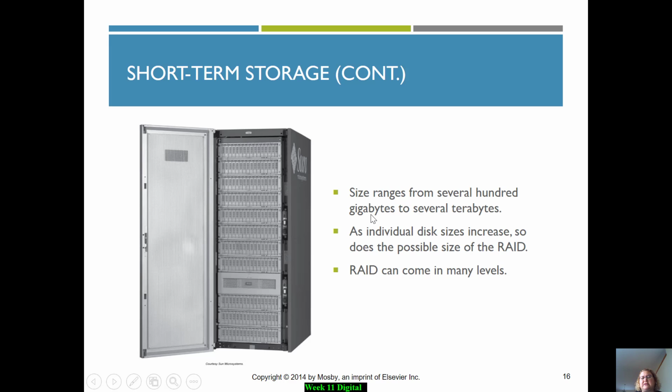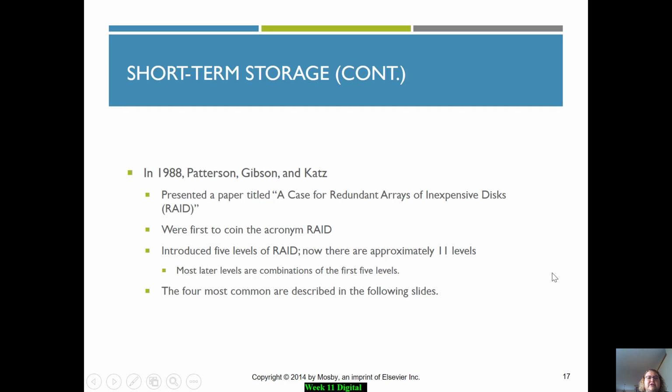We used to have devices that operated off of gigabytes, but even with your laptop computers, they all operate off these terabytes now. So this disk size can be increased, and it comes in different levels. It just depends on the hospital or the urgent care's need as to how much storage space they are going to have.